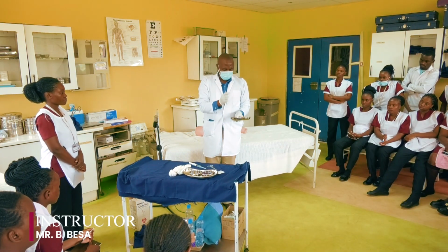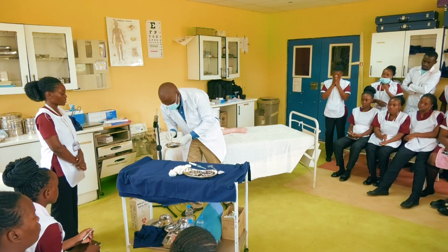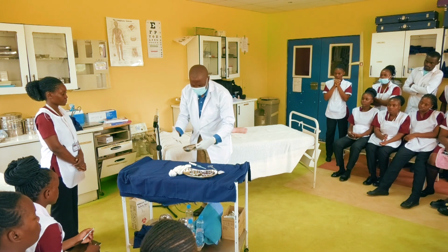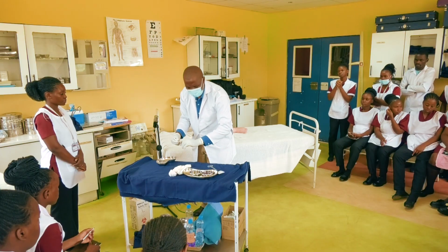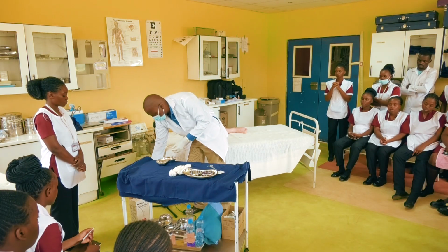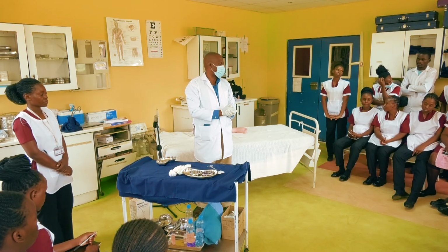When you're picking this, don't use your bare hands, please. Carry a forceps just to pick this to avoid injuries. So pick that, discard. Anything else will go into those other buckets for decontamination. Decontamination continues like that. So this is the sharp again, throw it away in there. Then the rest you take to the treatment room and finish up the dismantling procedure.